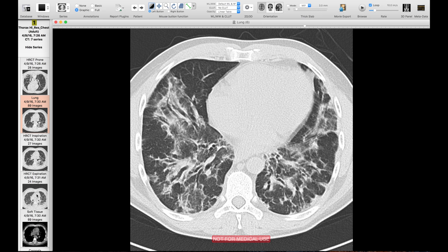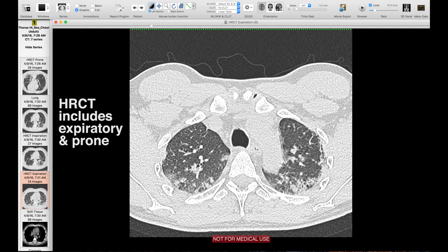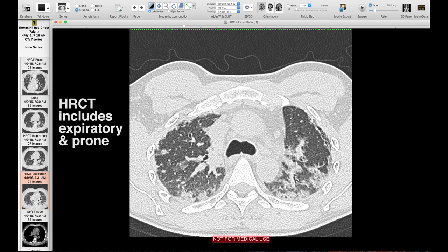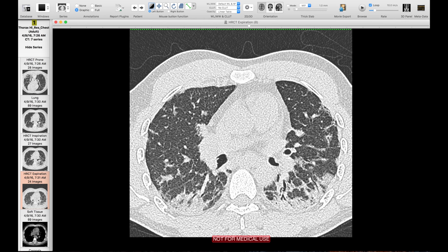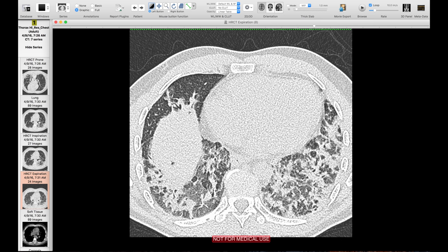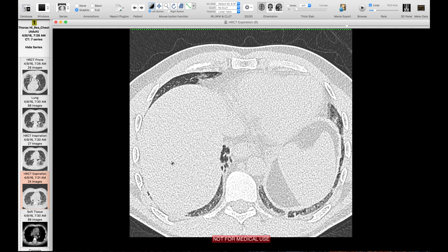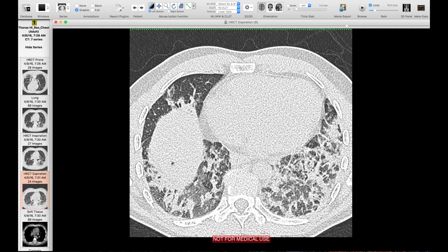HRCT also includes a couple of extra sequences beyond a routine chest CT. Most places acquire an expiratory series and a prone series. The expiratory series is what you see here — what you're looking for is air trapping. The lungs should become uniformly whiter as the ratio of lung tissue to air increases, and areas that are sharply demarcated and remain dark on expiratory images usually represent air trapping. You can see a little bit of air trapping on this patient.